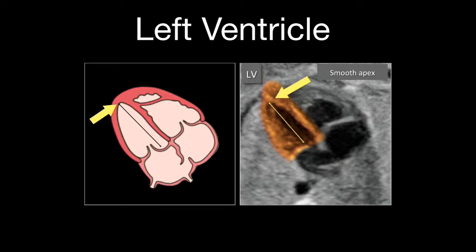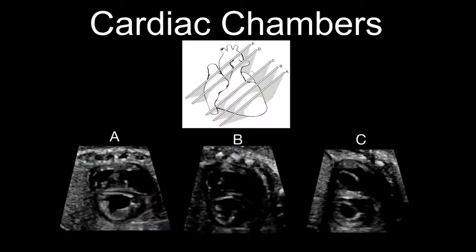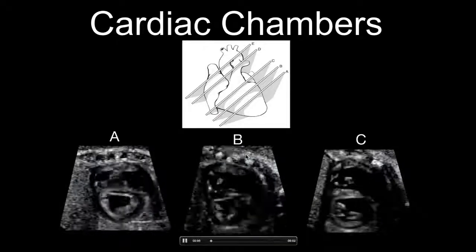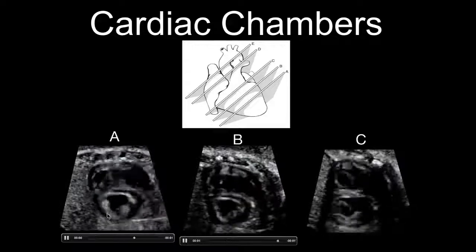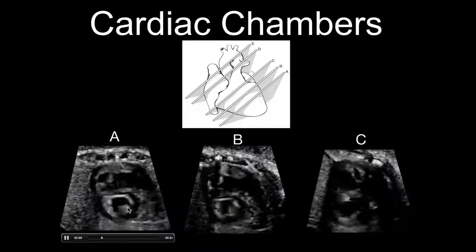That is lost in hypoplastic left heart syndrome and any congenital heart disease that makes the left ventricle smaller. As you see right here, that's what is meant. And you see the papillary muscles here with the insertions of the chordae tendineae. On cross-section, going from the bottom of the heart up towards the valves, you see the left ventricle here with these papillary muscles right here.